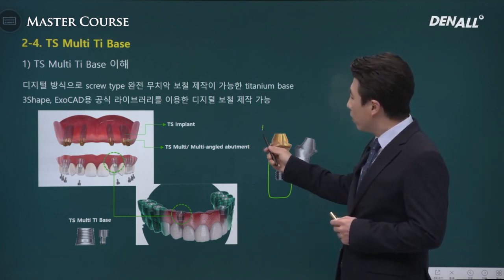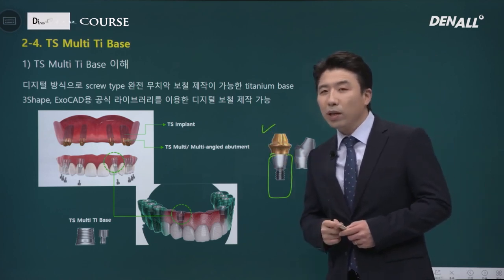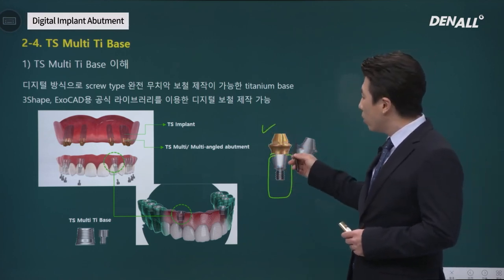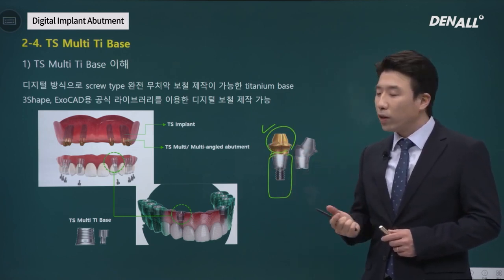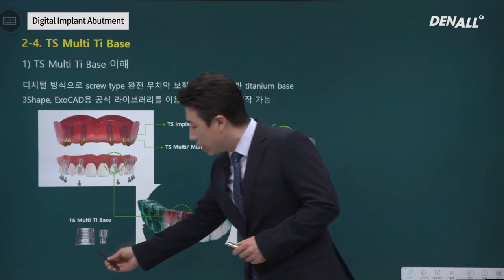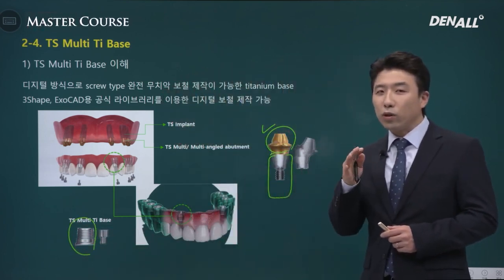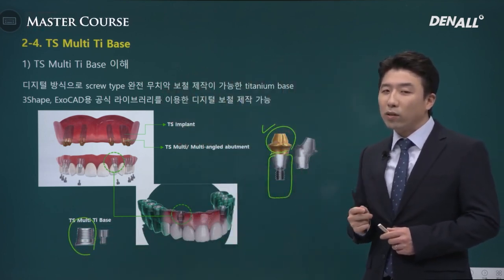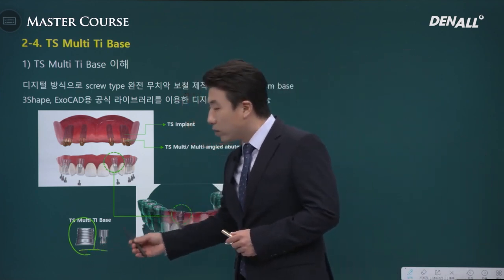The multi-abutment is connected to the internal type and changes the characteristics to make it like external implant. On top, cylinders can be used to finalize the prosthesis through cementation. There are cylinders that are casted as well.